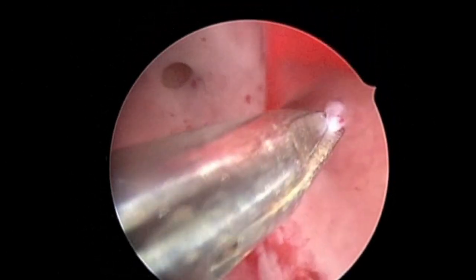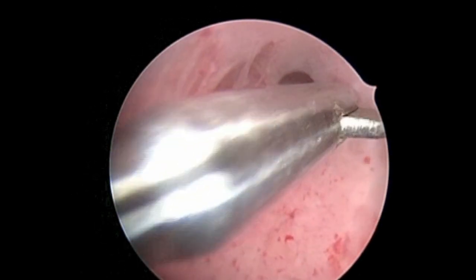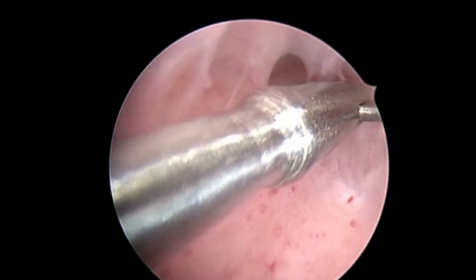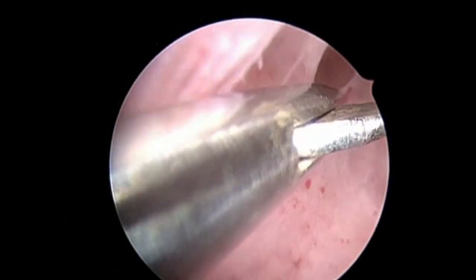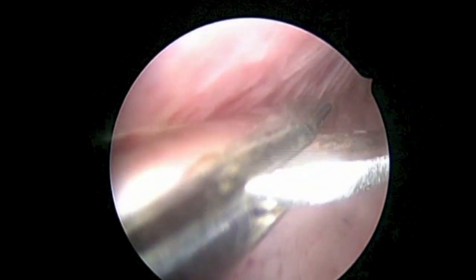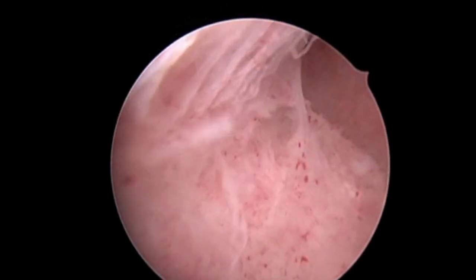At the completion of this case, the normal uterine cavity can be seen. The patient conceived three months following treatment and has gone on to have a full-term vaginal delivery. Although this is a low complexity case, it highlights the fact that a patient can avoid general or regional anesthetic for treatment of uterine adhesions. This procedure only took seven minutes to perform and the patient was able to go home shortly after.